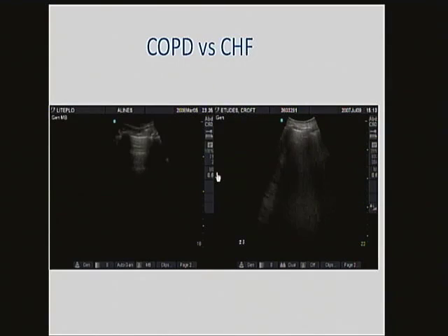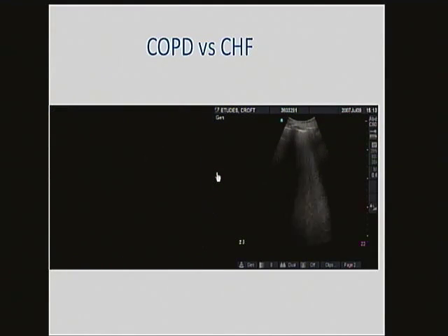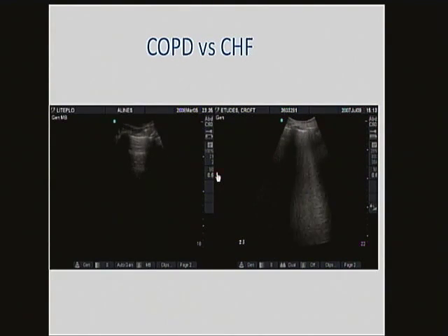And you can see it also when they're sitting up. So again, most of us, for example, when we look at the models, if the models have been lying flat for a little while, most of us get a little atelectasis and fluid collection in our lateral segments. So seeing a few isolated B lines in the posterior lateral segments of a supine patient is not pathologic.